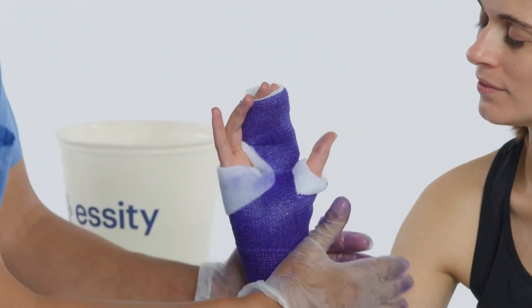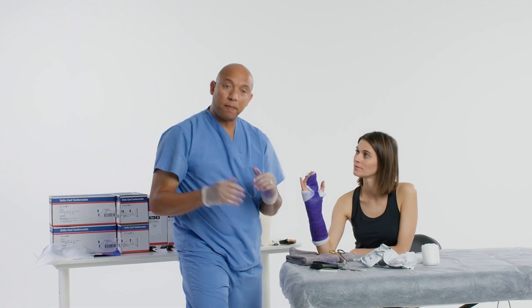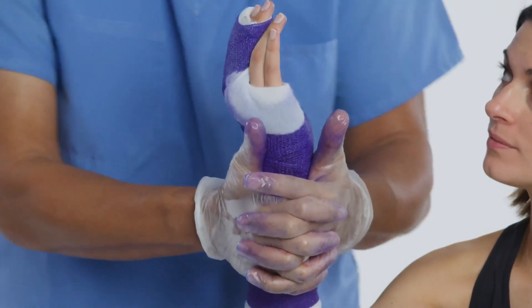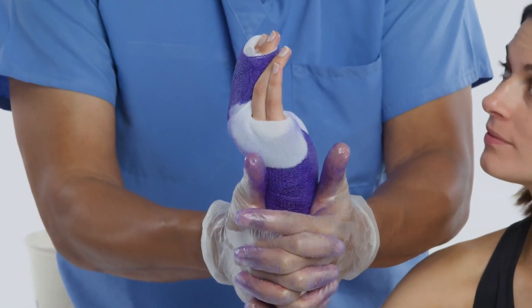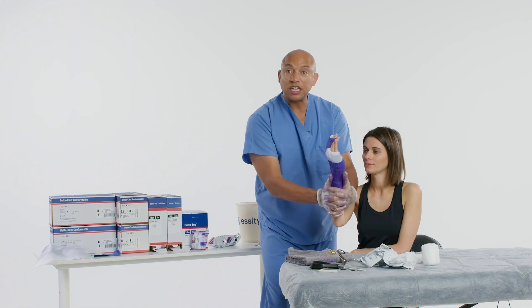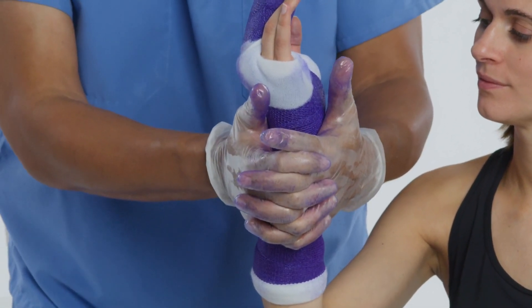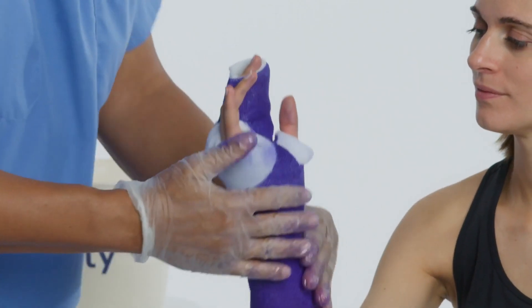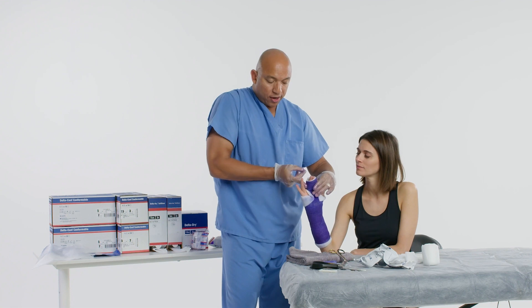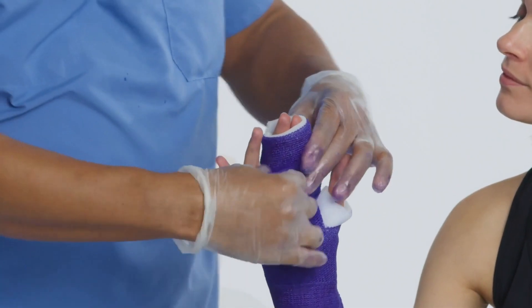Since it's time, I can go ahead and do an interosseous mold. I'm trying to make a flattened appearance on the dorsal and volar aspects — I'll hold the arm up so you can see. Hold that for at least three to four seconds, then work your way proximal. Make sure you have the patient's arm in a neutral position, because you're trying to limit supination and pronation with this cast. As a short-arm cast with fingers involved on the radial gutter side, I'll also go between the fingers and make a flattened appearance so it doesn't bow out too much, which would interfere with the range of motion of the uninvolved fingers.